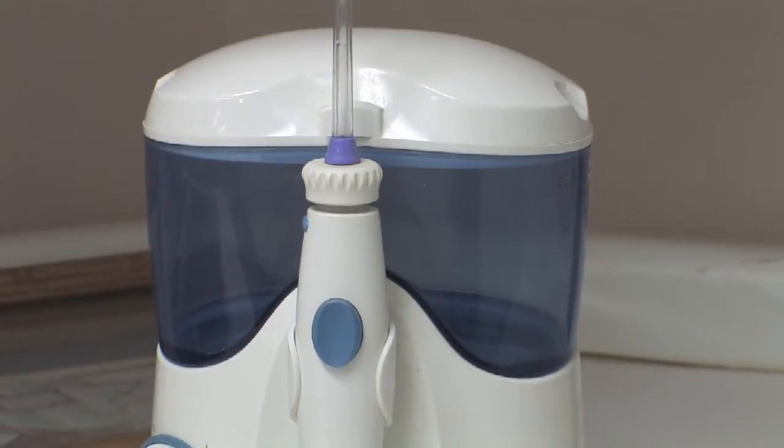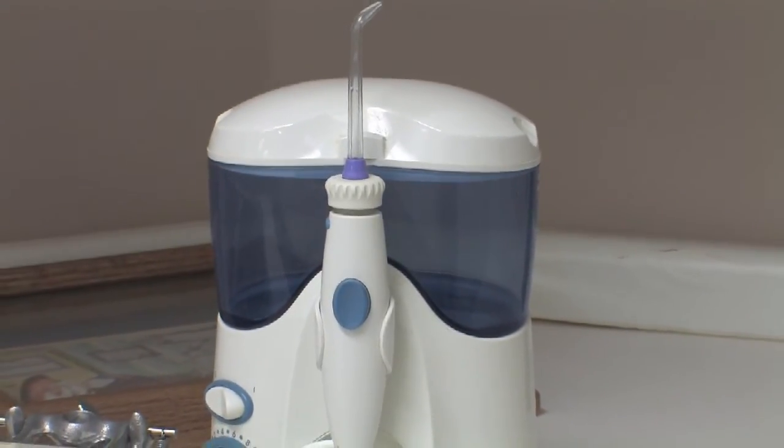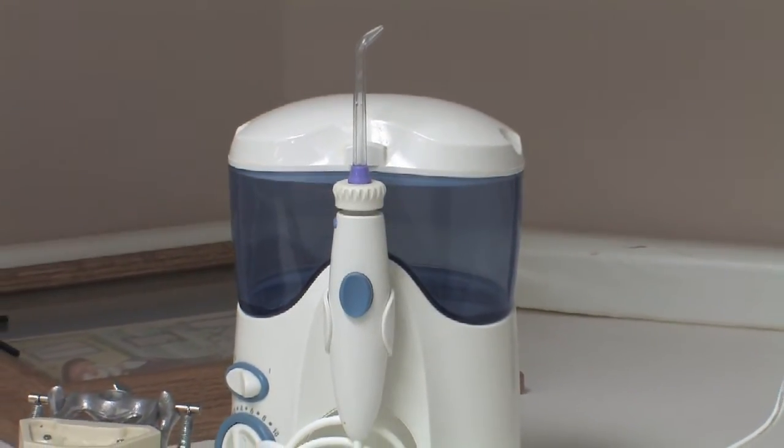Waterpik is another device that can be used to help with your oral hygiene. It's comparable to using a toothbrush or floss, but it works a little differently in the way it removes debris and food off the teeth. We always use a toothbrush and floss as the standard for removing debris and food that collects around and between the teeth.